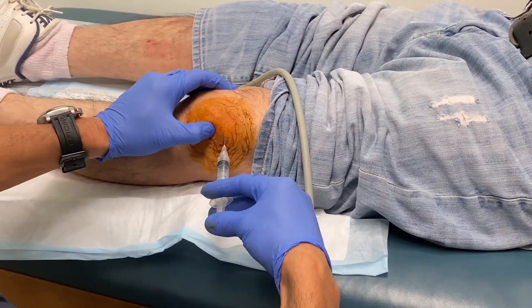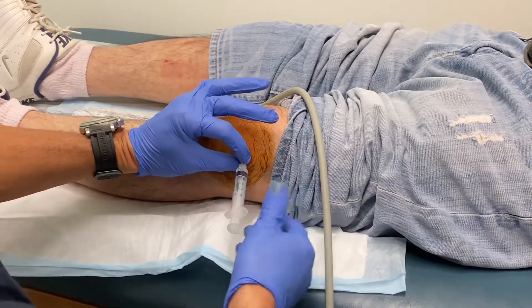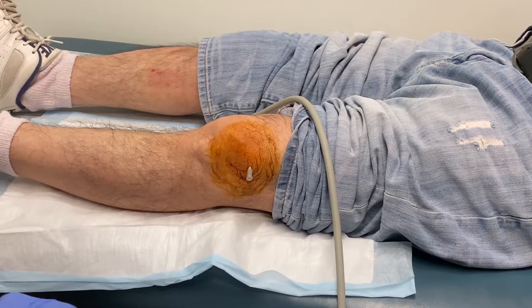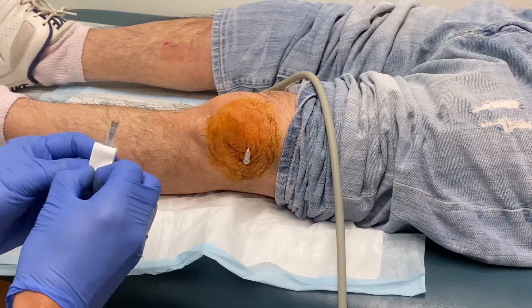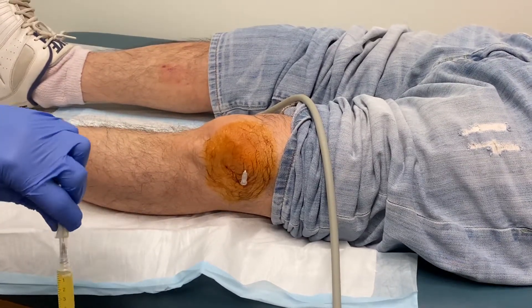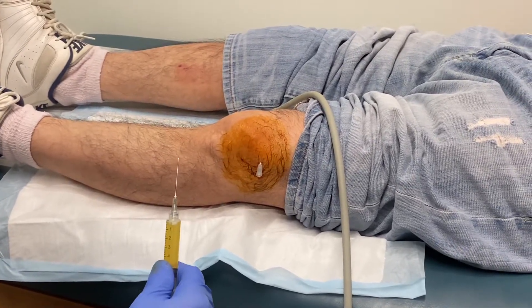I can feel the needle hitting the capsule — I can actually feel it. The needle just went through the capsule. So what I do now is I just leave this right there to help me with trajectory. Then I prepare to do the PRP, taking my time a little bit here to allow that lidocaine to work. This is platelet-rich plasma, double spun, so all the red blood cells are pretty much out. It's what's called leukocyte-poor platelet-rich plasma — that means it's mostly platelets, suspended in plasma.